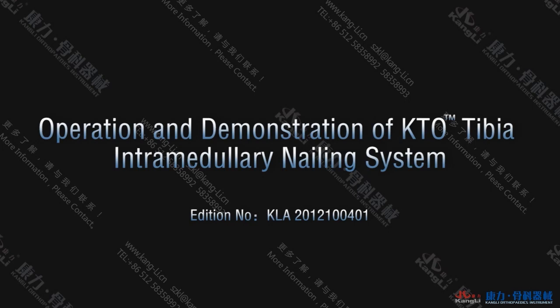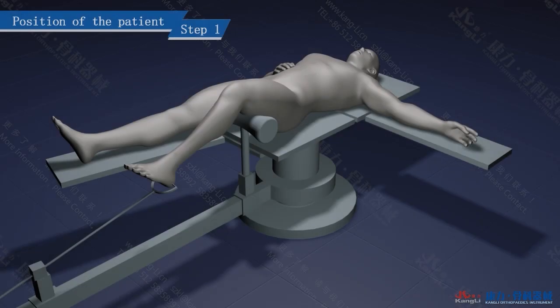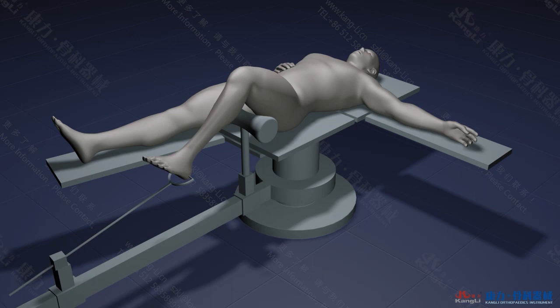Operation and demonstration of KTO Tibial Intramedullary nailing system. Step 1. Position of the patient. Place the patient on the fluoroscopic operation bed in supine position. The injured knee joint should flex at least 90 degrees to 100 degrees for the insertion of the nail. Perform traction reduction for the fracture, and when satisfied, fix it on the orthopedic bed.